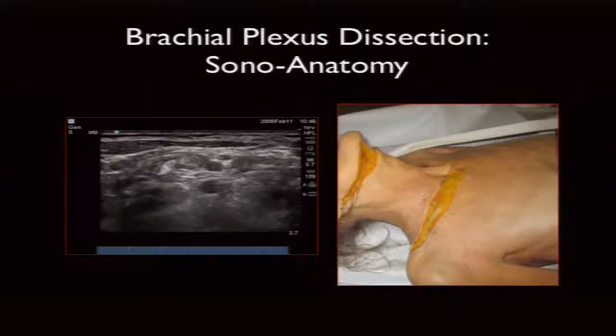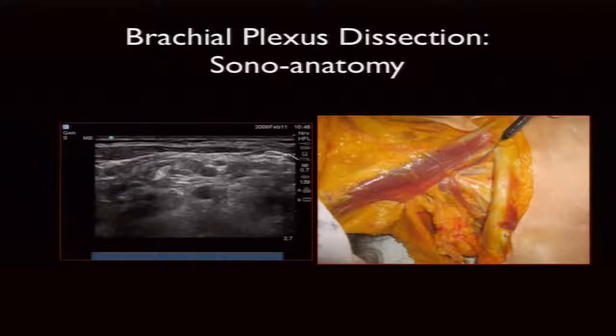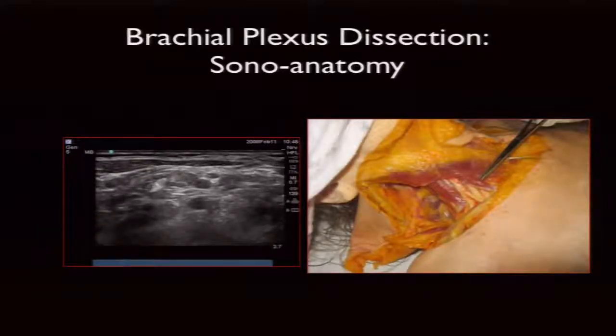How does this anatomy relate to what you see with patients? On the left is a brachial plexus ultrasound scan, on the right is cadaver anatomy with the flap replaced. At the very superficial part we see the skin as a white line. Below that is subcutaneous fat, and beneath that the sternocleidomastoid muscle begins to appear — highlighted in red on the ultrasound and visible as the strap muscle across the neck in the cadaver image.